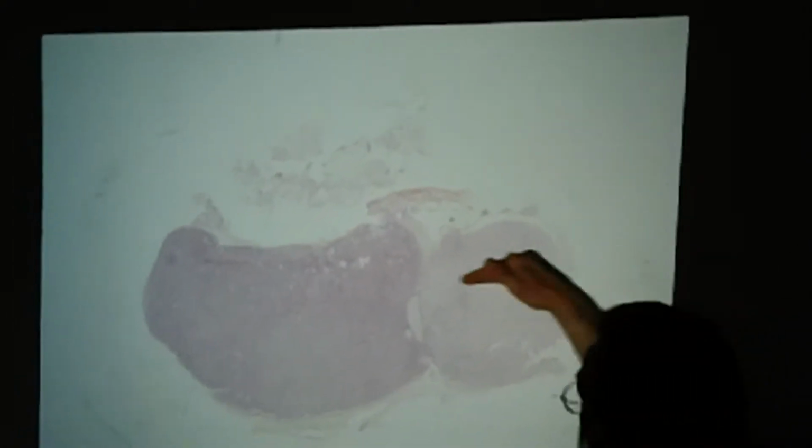All right, moving on to endocrine. Again, a lot of the slides of the pituitary were not sagittal or parasagittal sections like this. They were actually more frontal sections, so you're looking down on it.